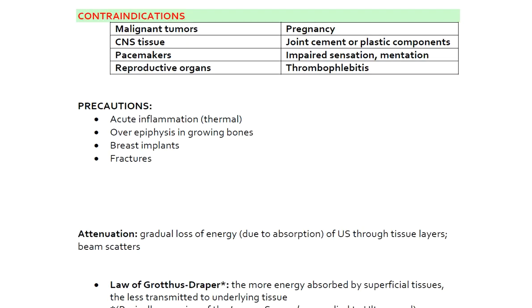So let's talk very importantly about some of the contraindications. With tumors or cancer, why would that be bad? Well, you can imagine that if you have a tumor, which is defined by rapid growth, and you're applying ultrasound to the area, it's going to provide a better environment for that growth, just like a hot pack would, but this is more significant than a hot pack, and it could be a deeper penetration. So that would not make sense.